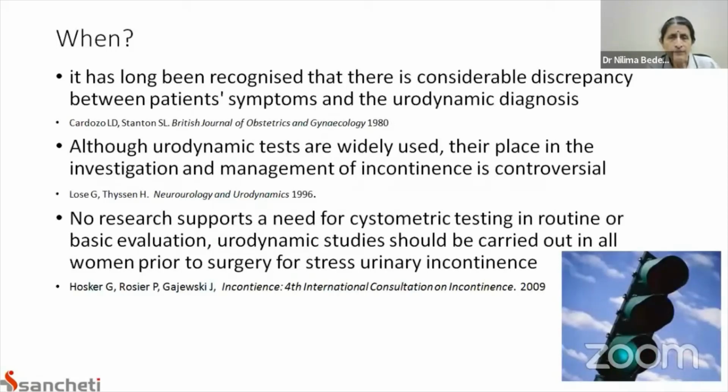And it is important to recognize that there has also been considerable discrepancy between the patient's symptoms and the urodynamic diagnosis. Although these tests are widely used, discussing management only from the test is not possible. So we need to have both in situ: the clinical evaluation, the patient's history and needs, and the urodynamic test. All these three need to be considered for talking about the management.